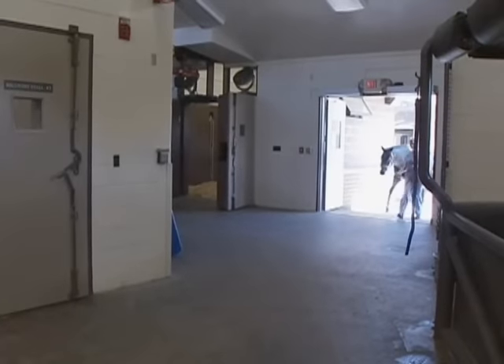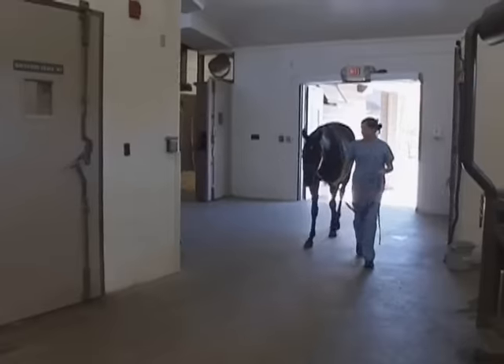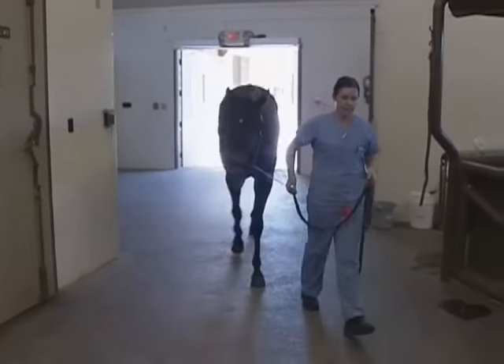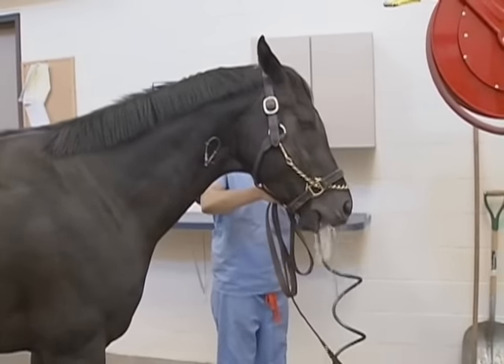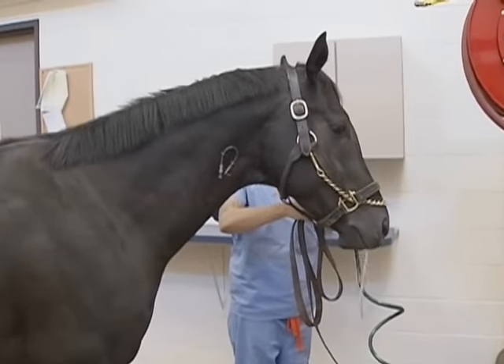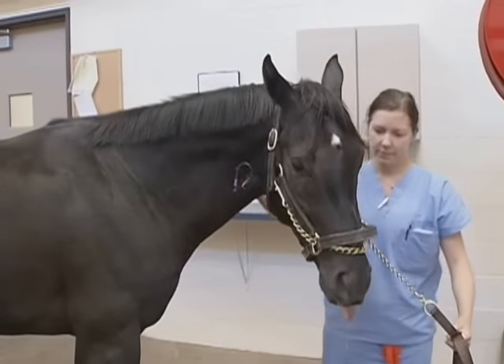It's very important that we have a quiet, safe environment for a horse to be both anesthetized, have surgery, and recover from general anesthesia. Prior to general anesthesia, we always make sure their mouths are rinsed out with water. We don't want to push any feed material, hay or straw, into their trachea, which potentially causes irritation or, in a worst case scenario, pneumonia.